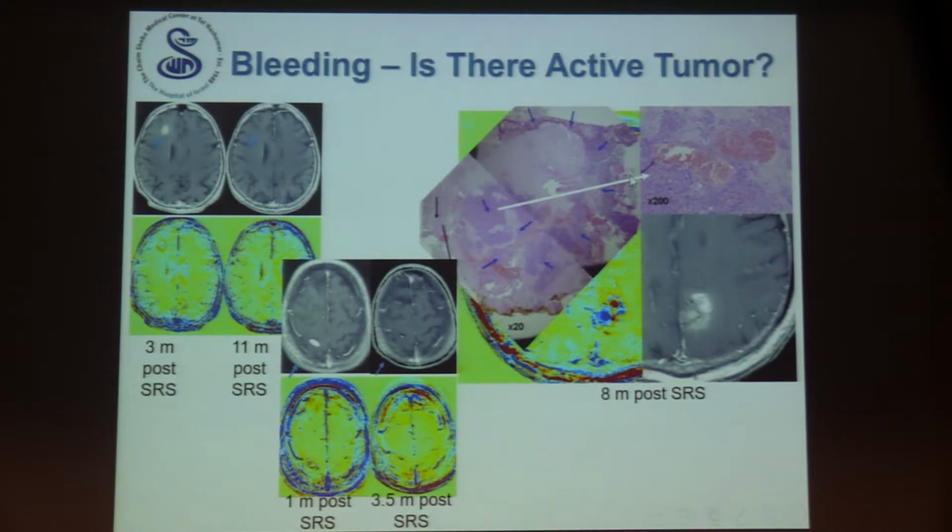The TRAMs have also additional applications, and what's nice about them is that they're not sensitive to susceptibility artifacts like perfusion or diffusion, etc. We are using robust T1 weighted images, so we are not sensitive to bleeding, for example. So the TRAMs can be used in order to depict active tumor within bleeding. You know, we have a lot of bleeding in GBM and melanoma and so on.